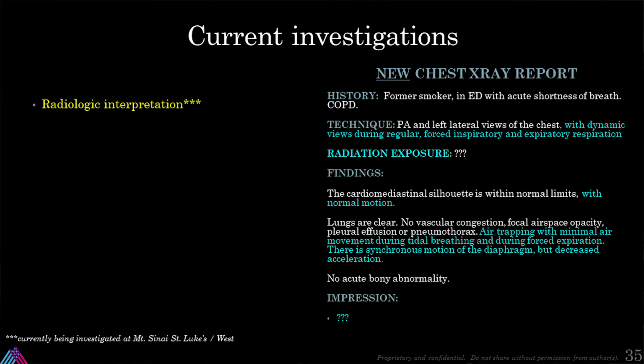So again, you'd have to change the technique. You'd have to say there's dynamic views during regular forced inspiratory and expiratory respiration. You'd have to put down the radiation exposure, which we will be measuring as part of our research, and the findings. Is there normal motion of the cardiomediastinal silhouette?